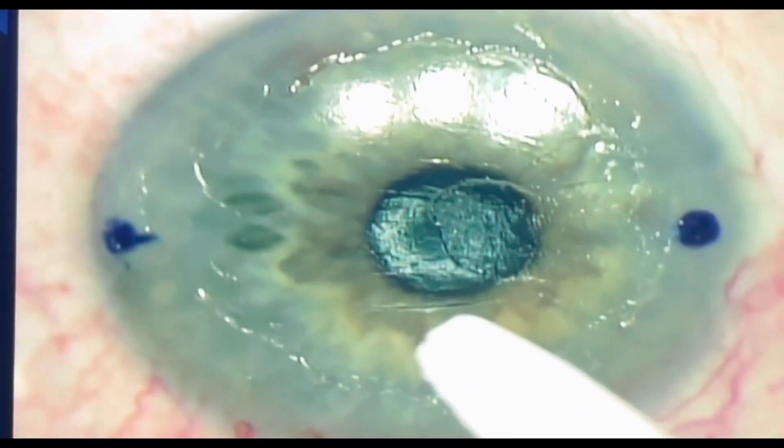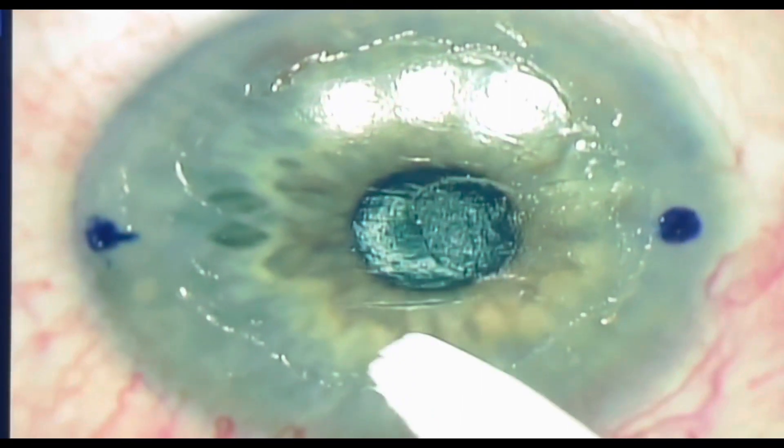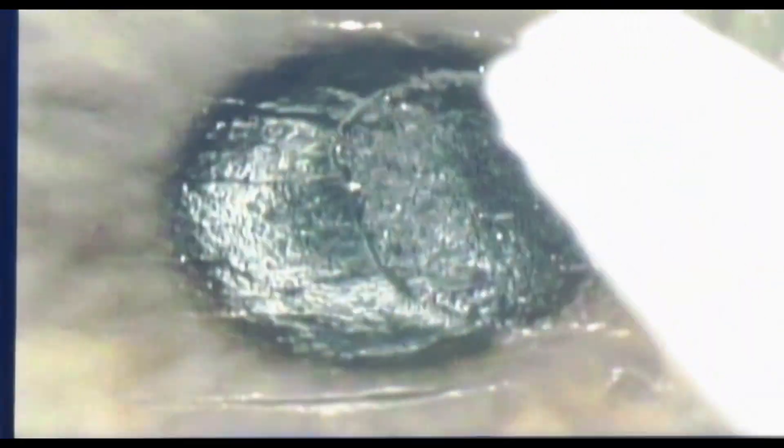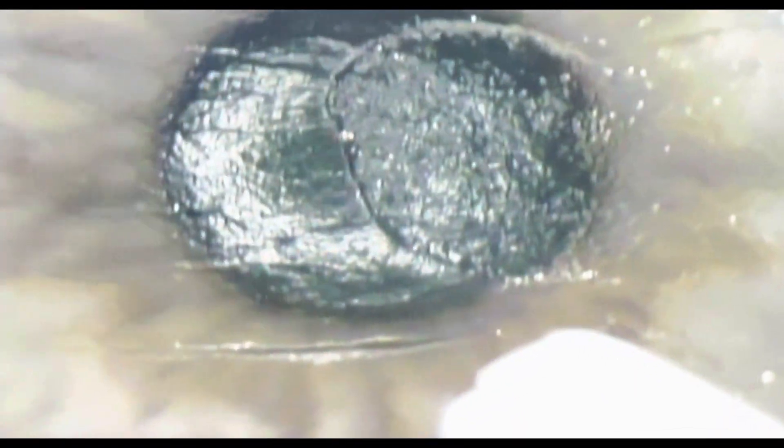You can see in this patient who had previous LASIK how we exposed this front area — what looks like an aborted flap — and there's a defect here in the LASIK flap. Under the Bowman's layer, all the secrets get exposed and you can see how the patient's surgery had gone before.